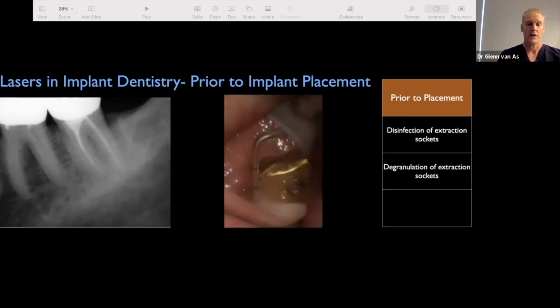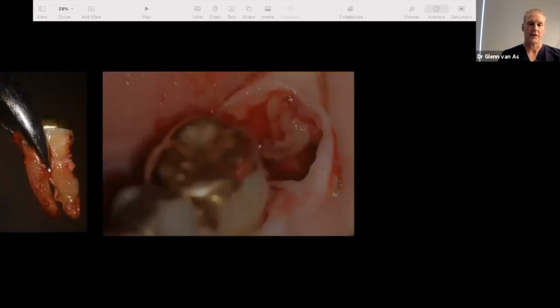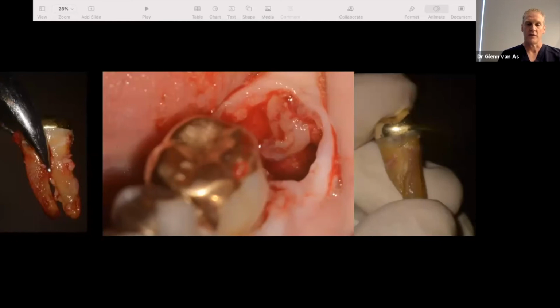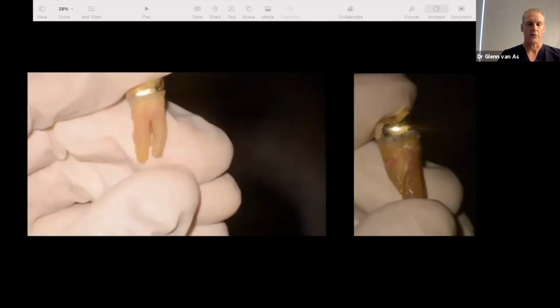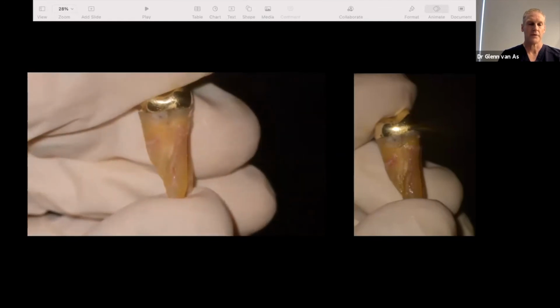Patient came in, 12 millimeter pocket on the straight distal that you see here on the gold crown. And we were able to get that tooth out. And through the microscope, it's kind of cool. When you look at the tooth, here's the socket and here's the tooth. And if I press play, you'll see at the different magnifications how clear the crack becomes. Here it is as we rotate the tooth, 2 power, 3 power.